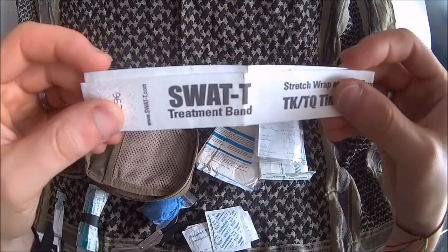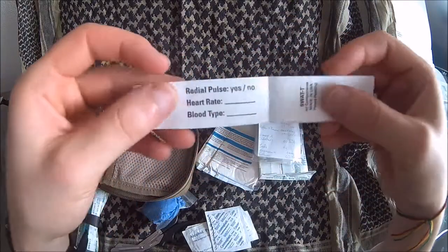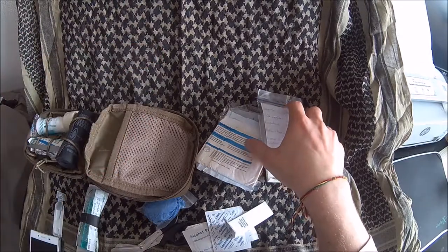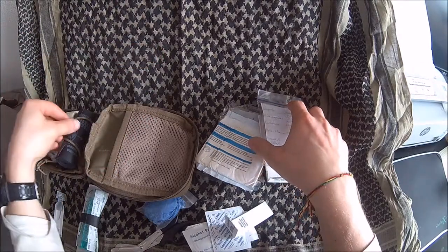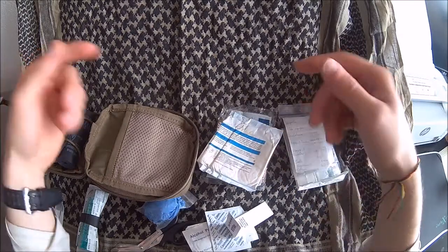Then we've got a tourniquet marker, which you're going to use to write down the time when you apply the tourniquet. That's very important, because the risks you encounter rapidly increase over time.